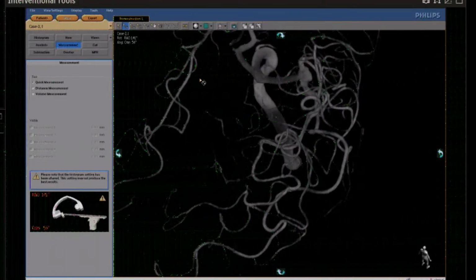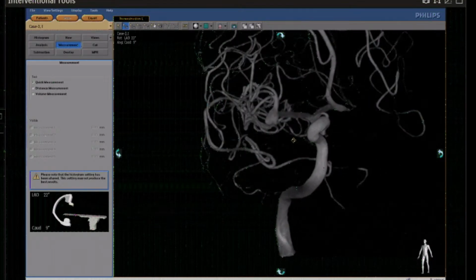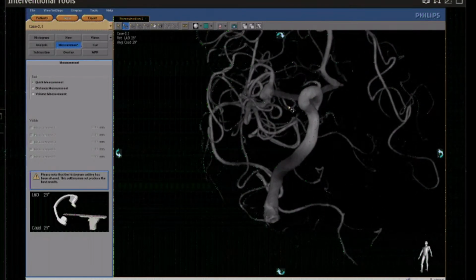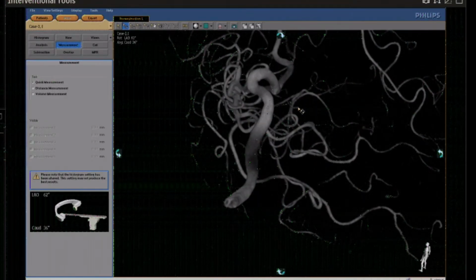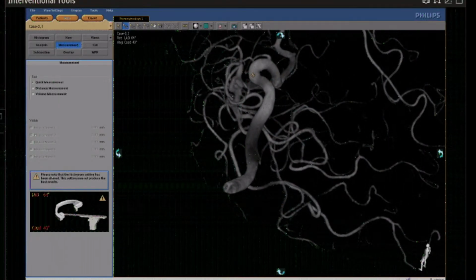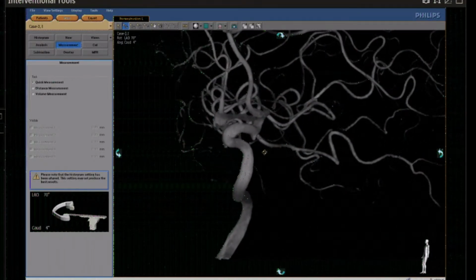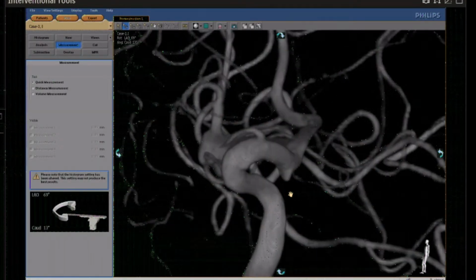My name is Mynzhylky Berdikhojayev, and my assistant neurosurgeon Abzal Khairatullah. We have patient number 2 with again an MCA aneurysm. The first patient was also with an MCA aneurysm, and now it's patient number 2. It's a wide neck aneurysm on the right MCA.